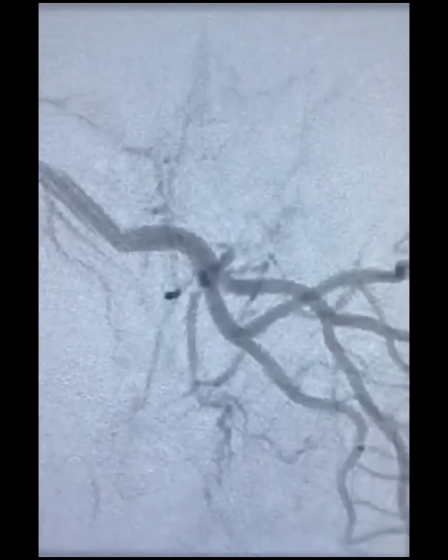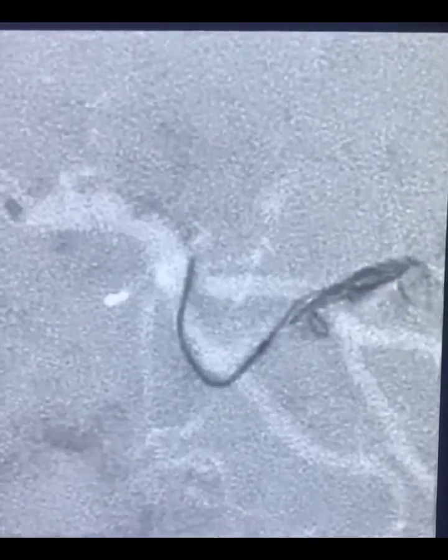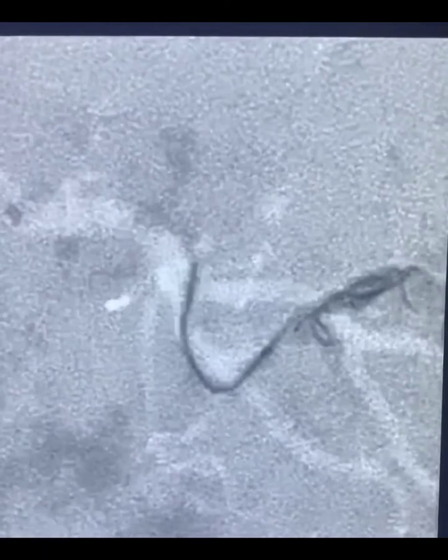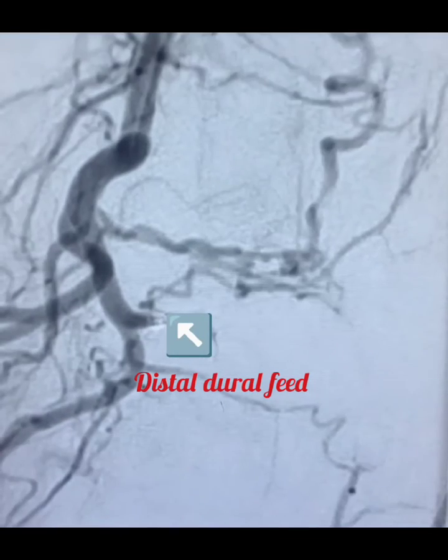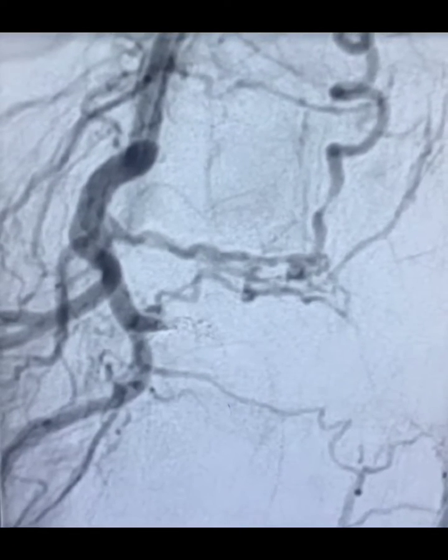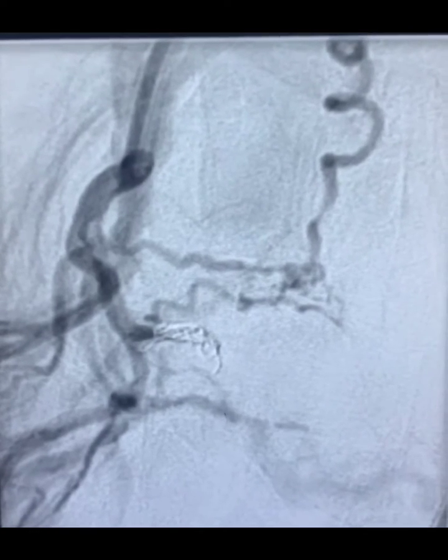The distal feeder was deemed to be not catheterizable, and the plan was to occlude this supply before targeting the main supply. Coils were deployed distal to the origin of the distal feeder to allow glue to percolate into this particular feeder. In this run, one can clearly visualize the distal feeder supplying the fistula. A microcatheter was then navigated into this feeder and glue was injected.